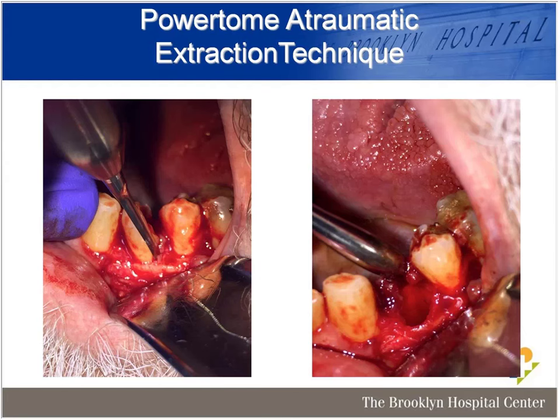Atraumatic extraction is the most important part of the case — the most important part of placing implants is starting with a solid foundation. This happens to be a paratome procedure; I wrote a chapter on atraumatic extractions in the Dental Clinics of North America. This is a powered periatome — an excellent device with a learning curve, but a wonderful tool for atraumatic extractions.